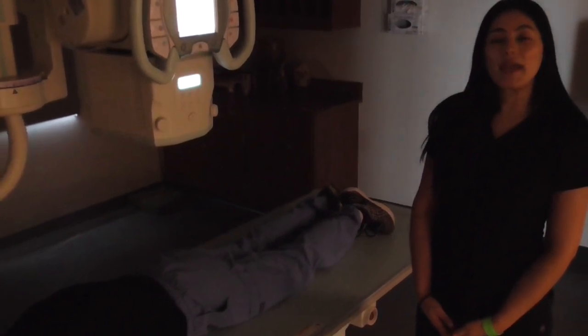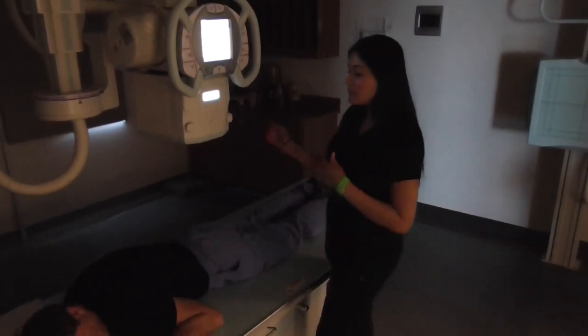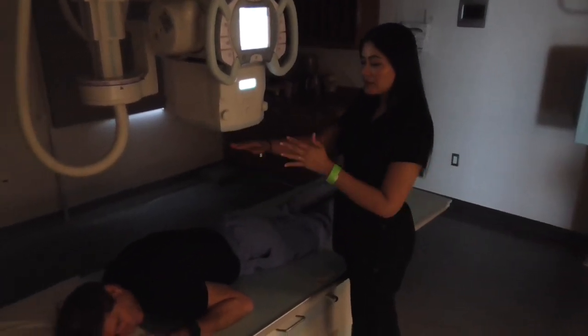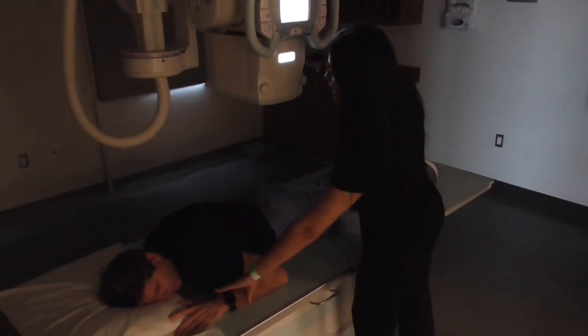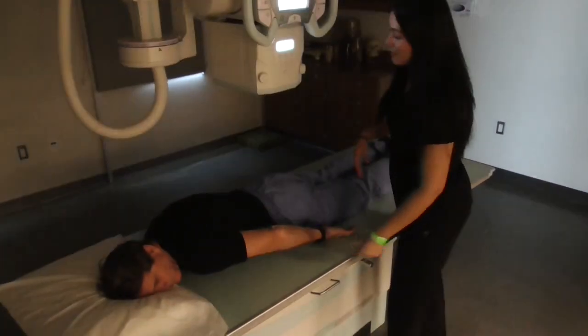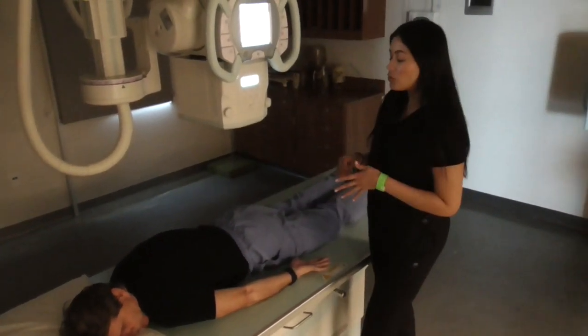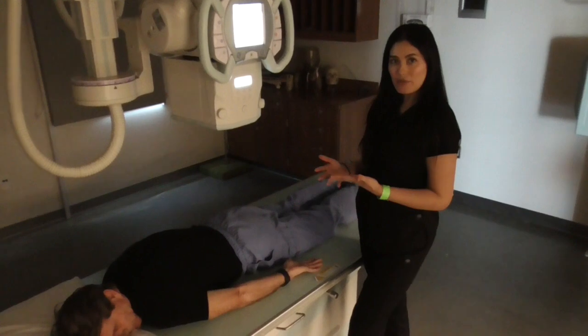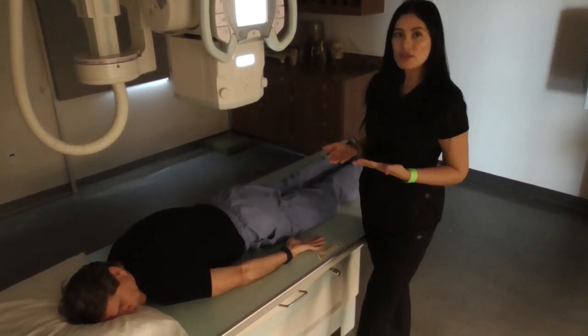I will now be demonstrating a PA abdomen. My patient is prone, face down, in the PA prone position, arms down by his side, making sure that we are nice and straight on the table. Our central ray will be at the same level as for the AP, so L4 or at the level of the iliac crest.